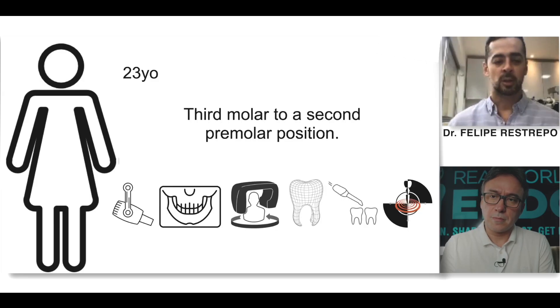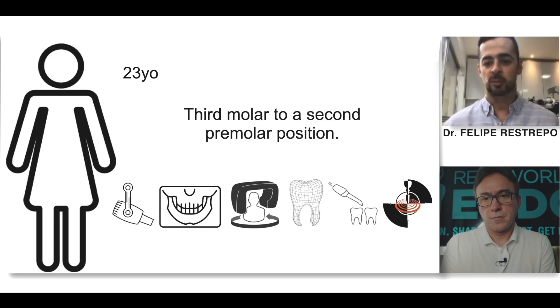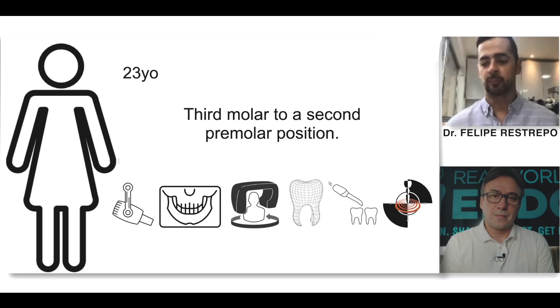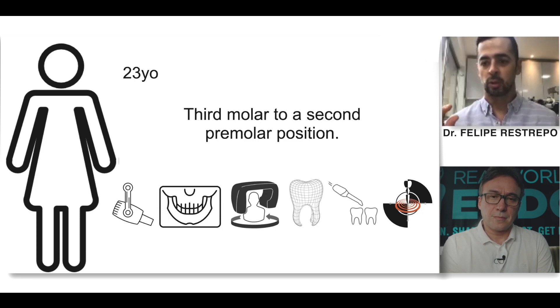What I'm doing right now is using dynamic navigation to do auto-transplantation in a planned, more predictable way. What this gives us is very short extra-alveolar time — that is what we want — just to reduce the extra-oral time of a donor tooth to just a matter of seconds. That's the main goal.